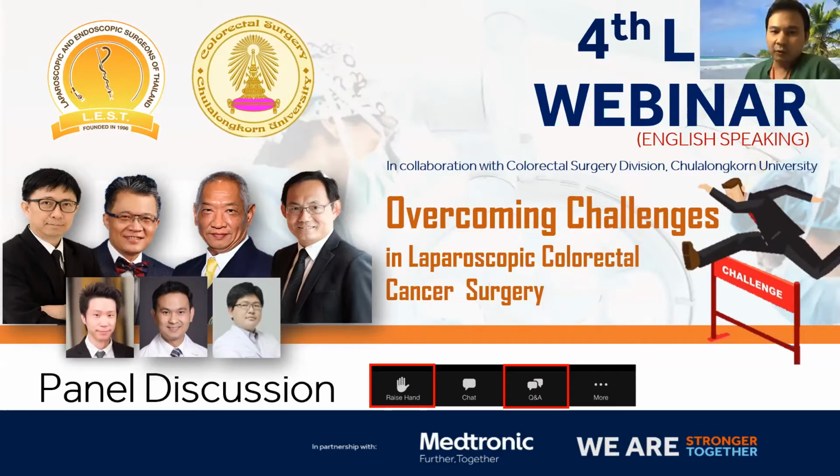The problem, I have to say that the 31 with hook, the ergonomic is very good. The suction and the button and everything is very good, but the tip of the device is very fragile, and sometimes I have to change the device many times because of the tips breaking.